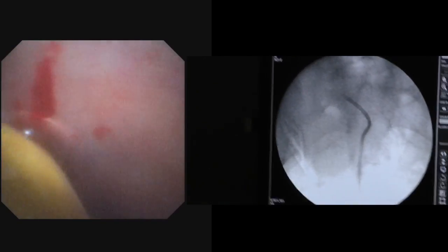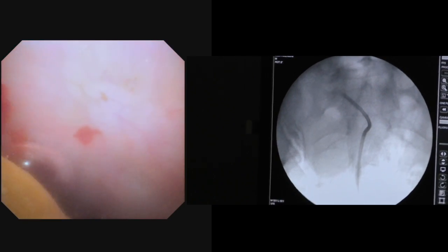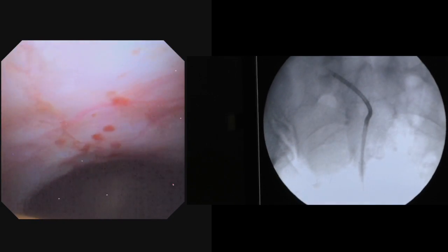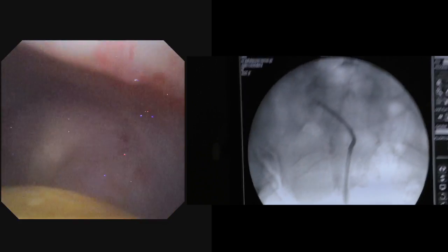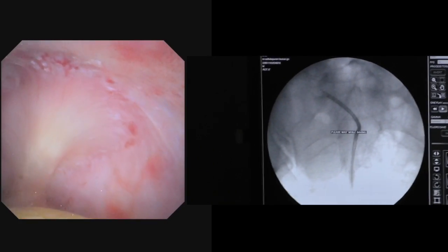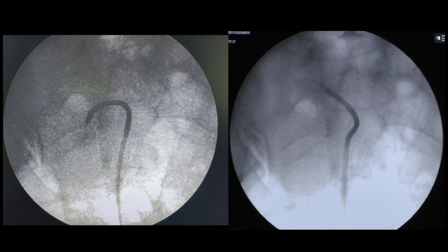We were lucky that day — we were able to basket the stone successfully, because if this had failed, we would have had to proceed with ultrasound or fluoroscopy-guided PCNL. This is the picture before and after basketing.